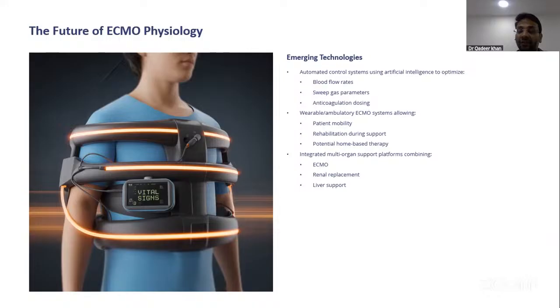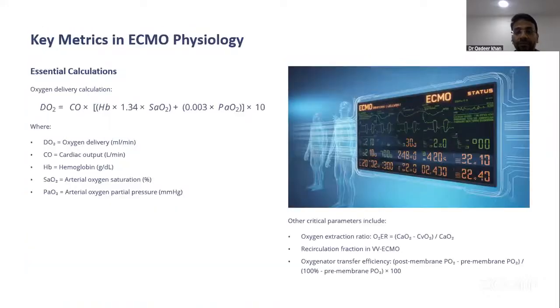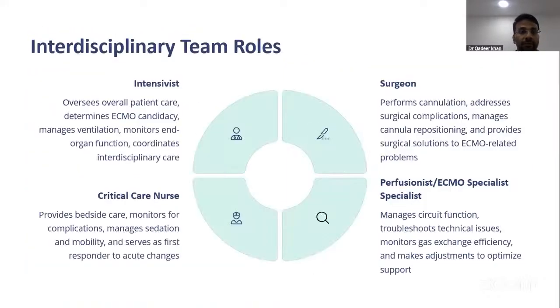And you need to understand that when we are providing multi-organ support, for renal replacement the best modality is CRRT, which will have a lesser impact on the blood flows and your oxygenation, and the main idea for which we have initiated the ECMO will be solved. It's an interdisciplinary role between an intensivist, nurse, perfusionist, and a surgeon. And as in most cases we are doing percutaneous cannulations, still the cardiovascular team has to be available, and it is mainly a multidisciplinary approach.